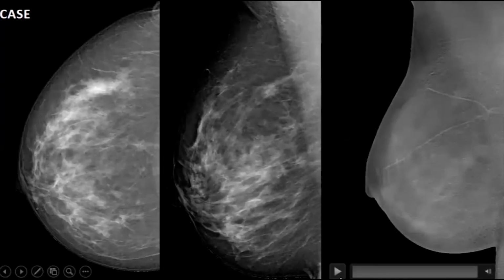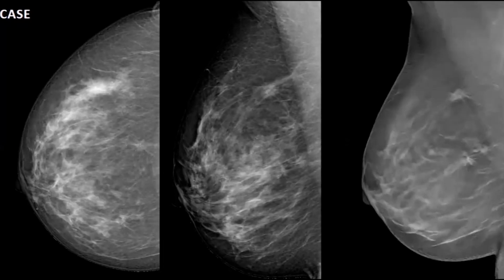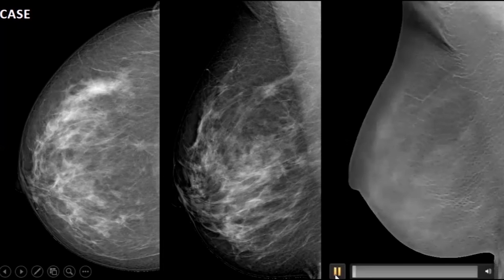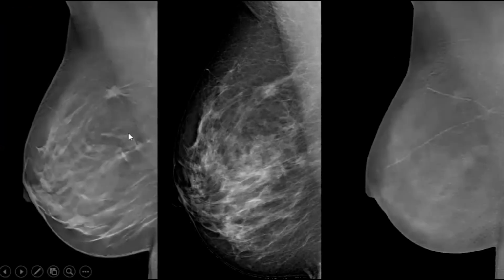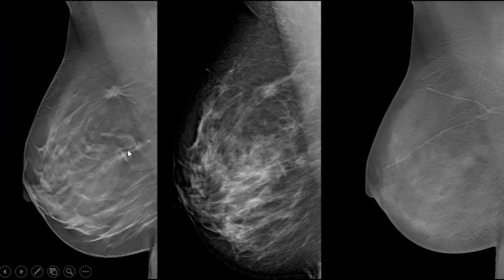Later on, we did tomosynthesis on this case. First step of examination: tomosynthesis shows you for sure a clear tumor at 12 o'clock. Go on. And maybe some distortion here. So if you look at one special slab which was produced during the tomosynthesis, you have a lesion here and maybe two lesions here, but you don't really have a 3D imagination of what's going on.